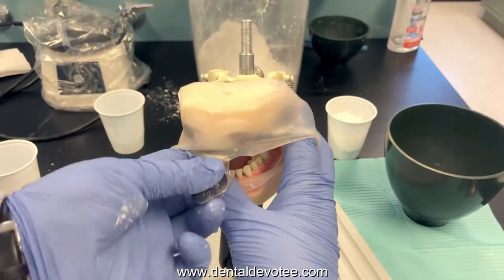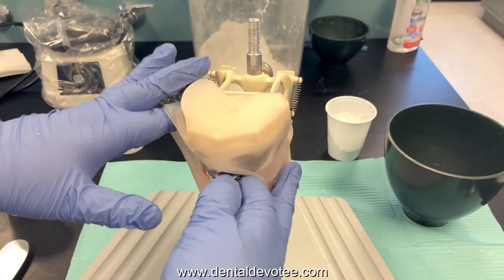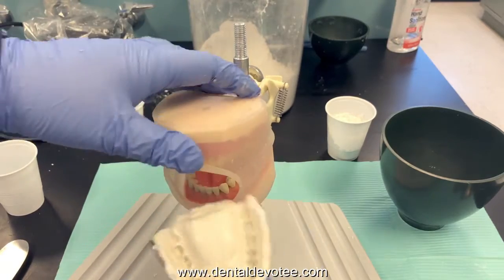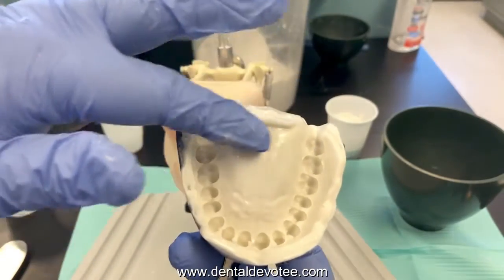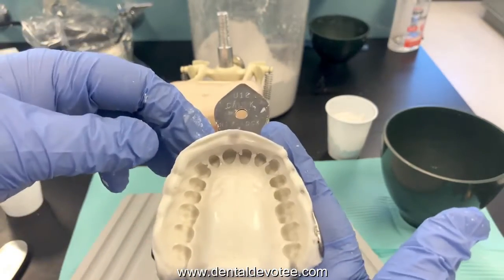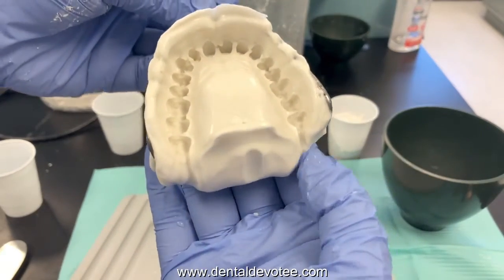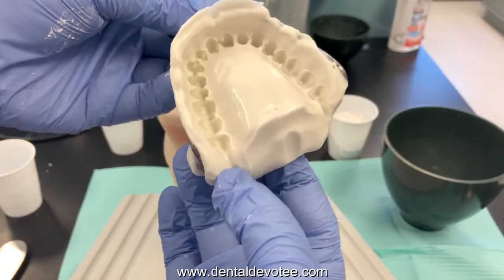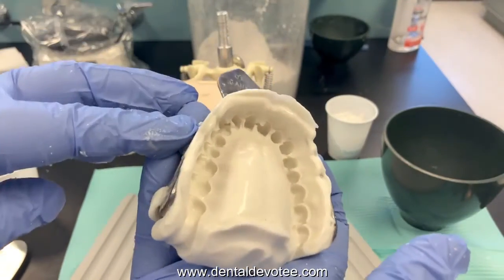In my opinion, this is the hardest part with mannequins. Loosen up both sides if you can, all the while pulling down on the anterior. Slide it out at an angle. Inspect your impression — you're looking for detailed anatomy. You don't want to see any voids or bubbles. The impression should be centered in the tray, with the two centrals right at the center. We've captured all the teeth. The tuberosity area had a little issue with material flowing back, so it's a little distorted there. The peripheral roll is nice — a nice border around the impression.